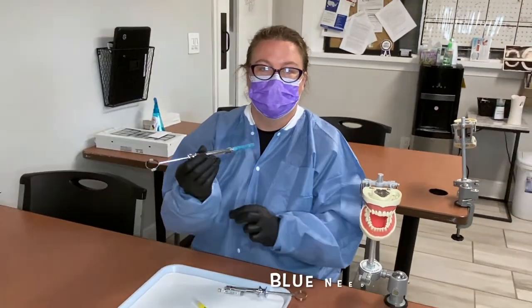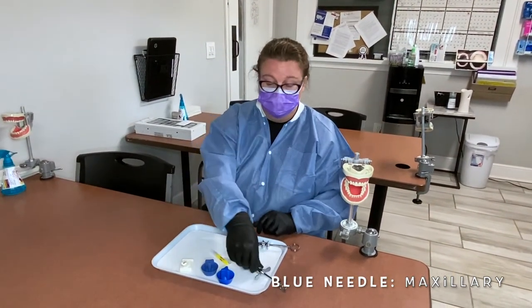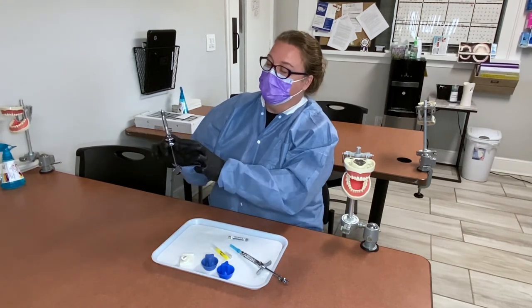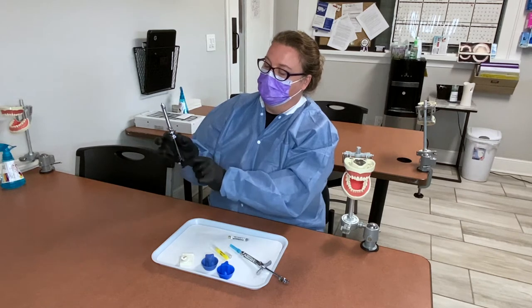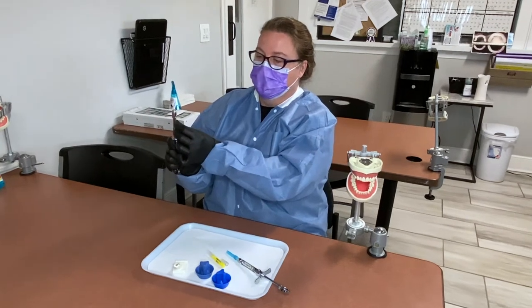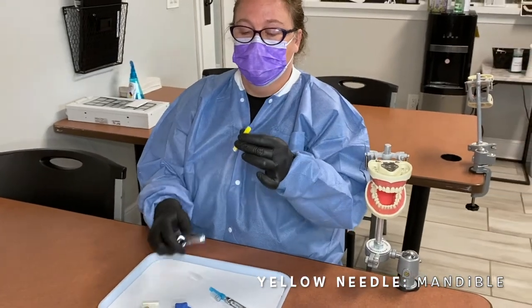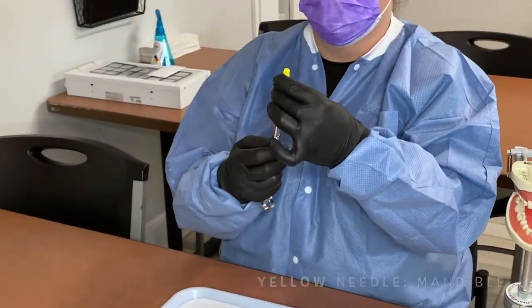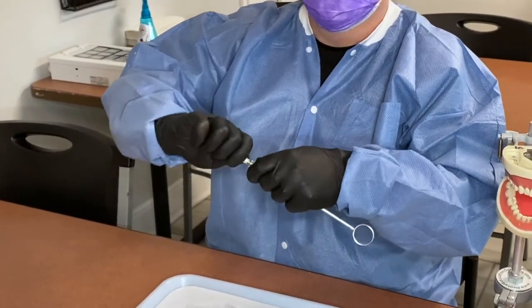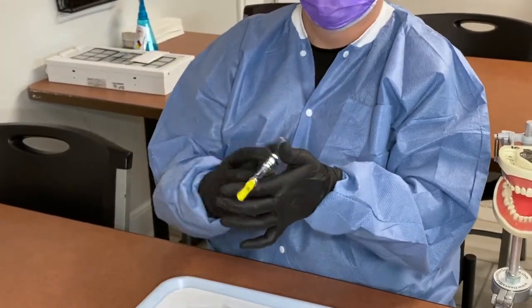This is your blue needle — it's ready for anything on the maxillary. The other syringe does not have wings; it has a harpoon inside. Take your thumb, push up, your little finger push down — up and down — rubber stopper inside, and let go. This is the yellow needle for your mandibular. Put it in, twist, and gently harpoon it, and you're ready to go.